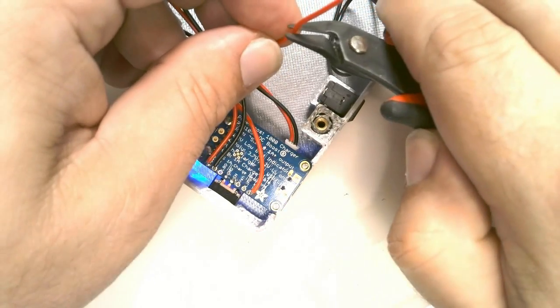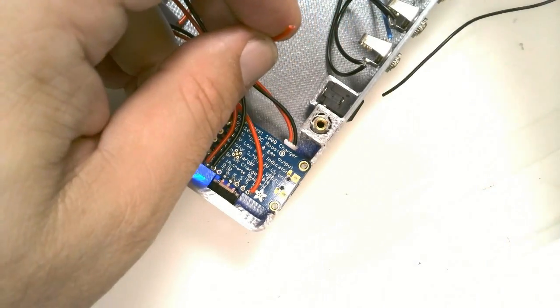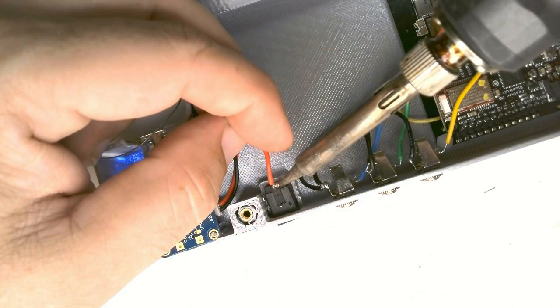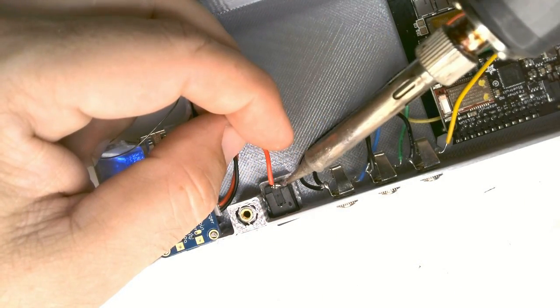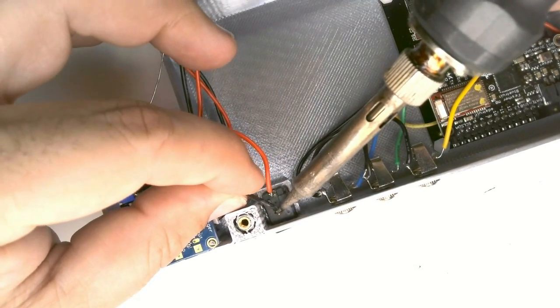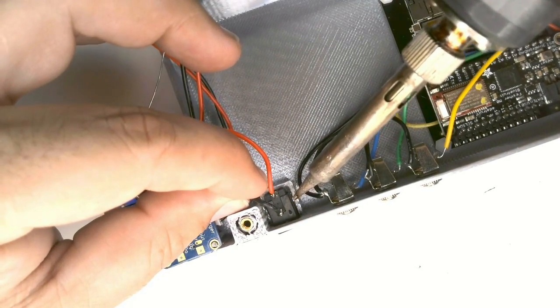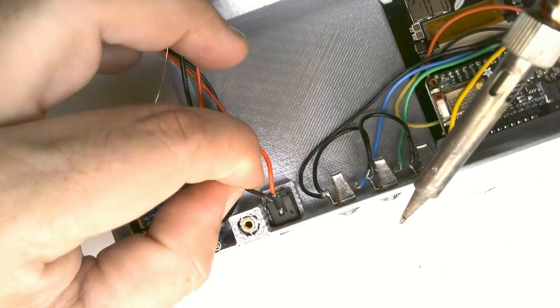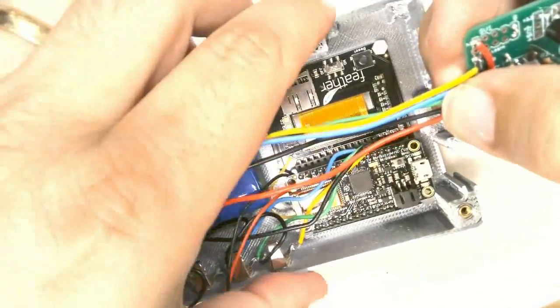We connect the red USB wire from the power boost to the terminal on the barrel jack. Then create a new black wire to solder to the other terminal of the barrel jack. There is a third terminal on the jack alongside of it, but we don't use that one.